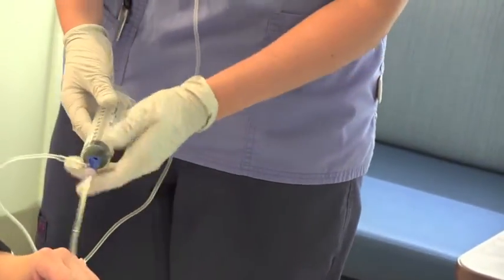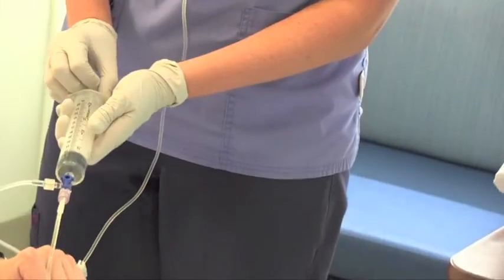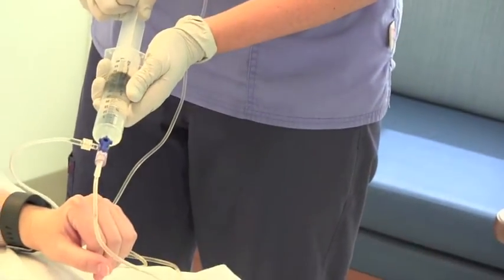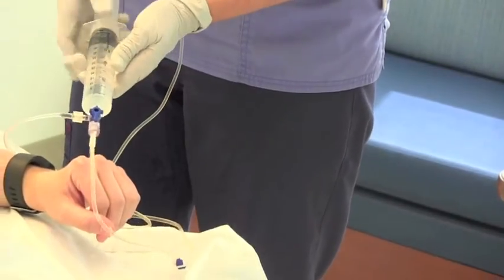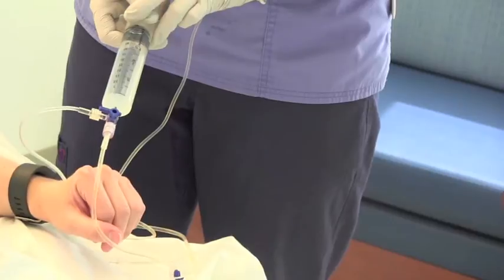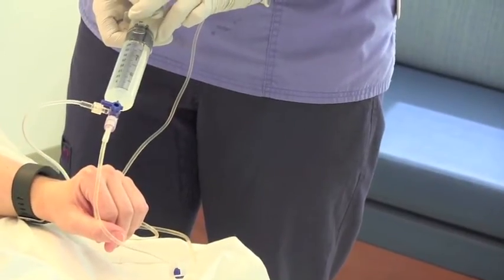So now you'll turn the stopcock off to the patient and open to the normal saline. Off to the bag again, and then flush into the patient's IV.